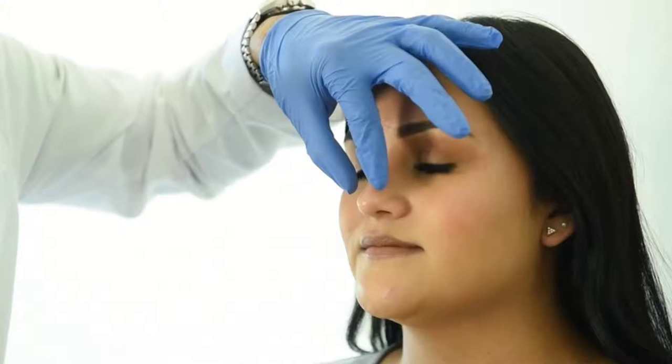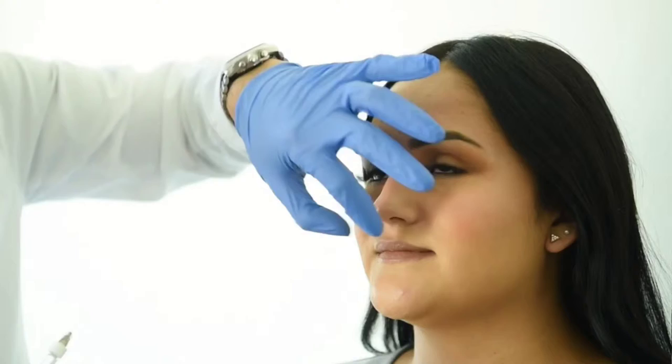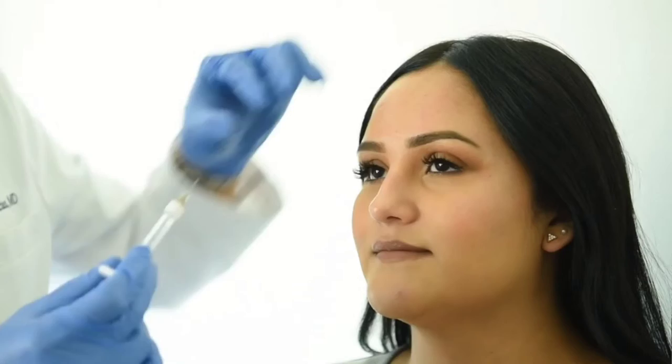I'm doing a non-surgical rhinoplasty here. I'm going to mask the bump here. She has a little dorsal hump and then a little narrowing right here in this part of the nose. She gets a little more asymmetric — a little bit more on the right than on the left — and she could use a little filler here in order to rotate the tip of her nose up a little bit. I usually start with the augmentation of the dorsum here to mask the bump on the top part.